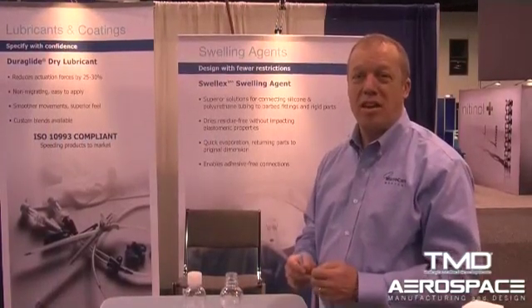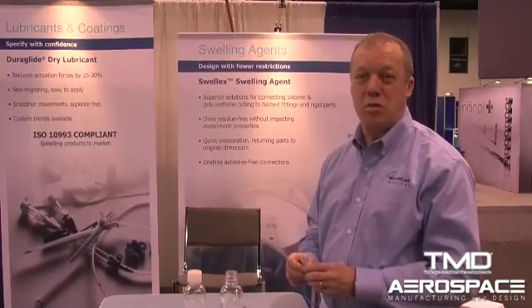One of the products that we're showing today is Swellex silicone swelling agent. It's used on swelling silicone tubing so that it makes it easier to fit onto fixed fittings. The advantage of Swellex is it takes the tubing and it'll expand its size without affecting any of its physical properties. So its color and its durometer all stay the same. However, it swells up the size significantly.